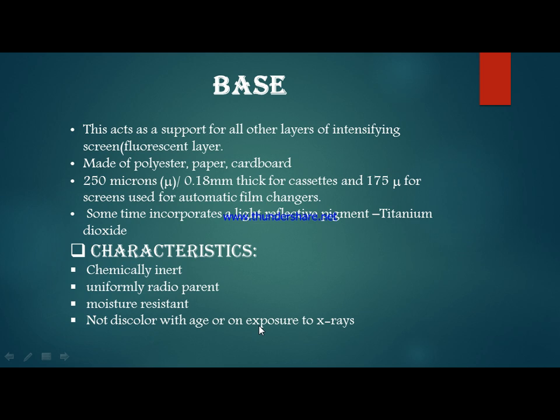First one is the base, which always acts as a support for all layers of the intensifying screen. It is made up of polyester, paper or cardboard. Sizes are 250 microns or 0.18 mm thick for a cassette, and 175 microns for screens used for an automatic film changer. Sometimes it incorporates a light reflective pigment like titanium dioxide. Its characteristics are that it is chemically inert, uniformly radiolucent, moisture resistant, and does not discolor with age or on exposure to X-rays.